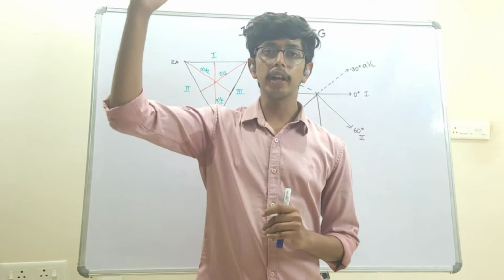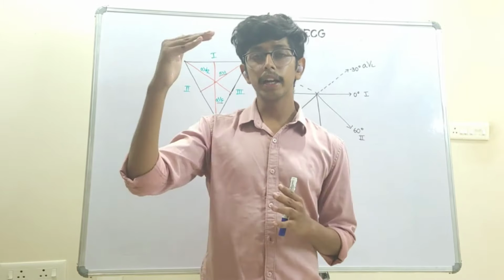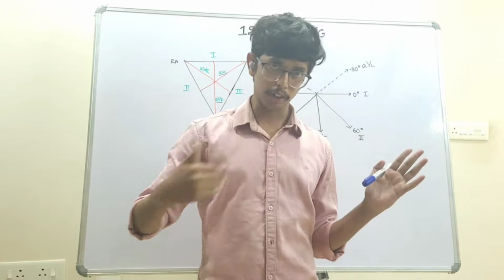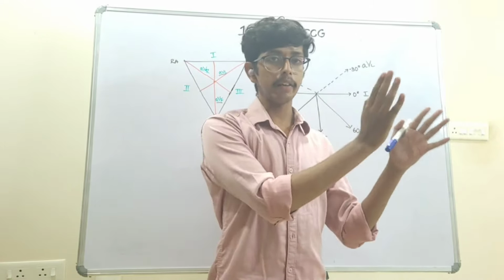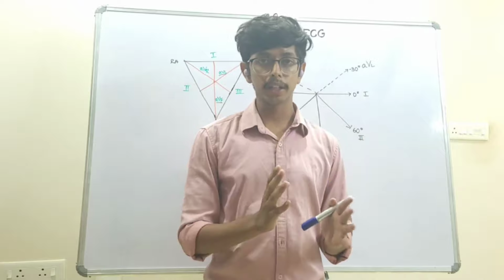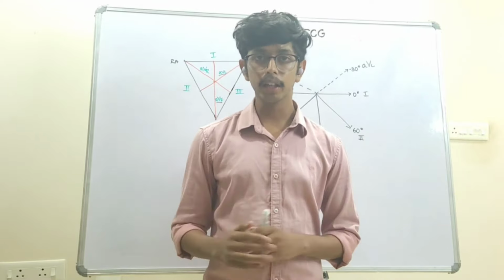Lead 1 and AVL, which are located at the top, will not see this wave so much. So in lead 1 and AVL we will see small waves. And finally the lead AVR, which is opposite to the direction of the depolarization wave in the heart. So in lead AVR, naturally we will see negative waves. Now did you understand why we see negative waves in the AVR? Why we see bigger amplitudes in lead 2 and then AVF and then lead 3?